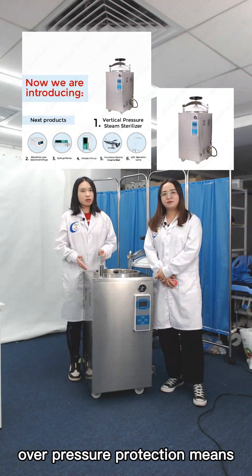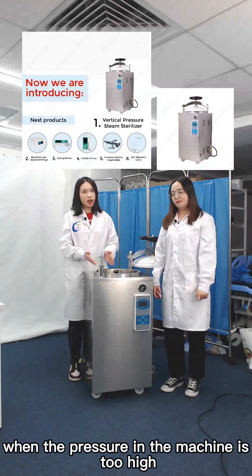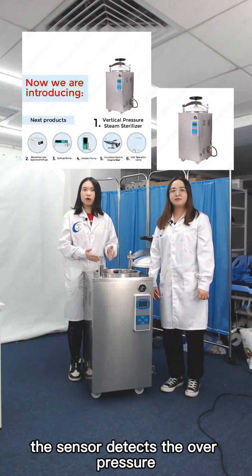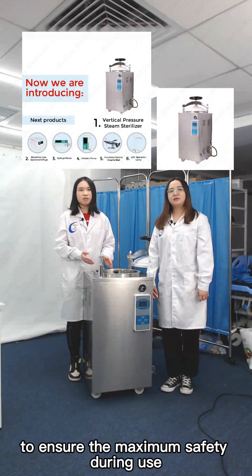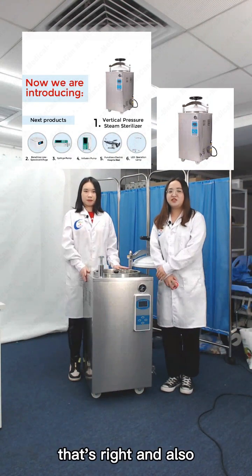Over-pressure protection means when the pressure in the machine is too high, the sensor detects the over-pressure and the sterilizer will automatically stop, ensuring maximum safety during use.